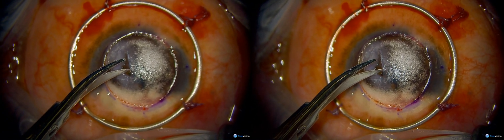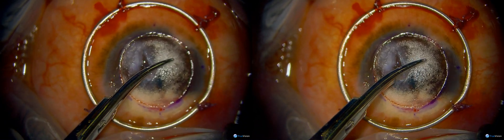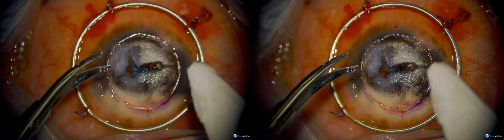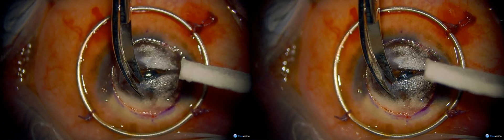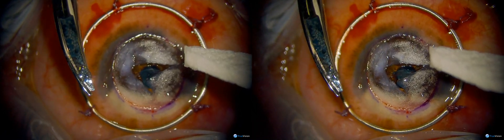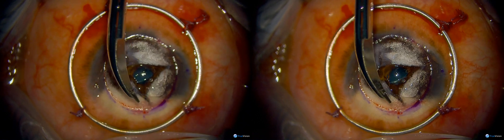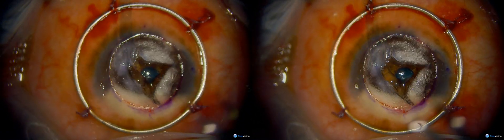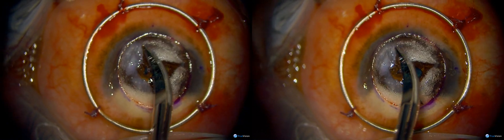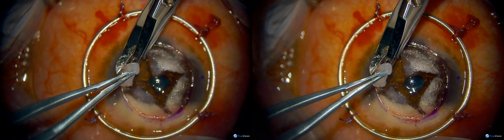These are the scissors that are blunt on the bottom and a little longer on the bottom as well, and she's cutting the lamellae into quadrants so they can be removed. Real care is taken here not to cut Descemet's membrane, always improving the view by removing some of that viscoelastic and always using a little more viscoelastic if needed to push Descemet's membrane and Dua's layer complex posteriorly. It looks like she almost has it in the four-petal pattern here, extending it all the way out to that area of trepanation, which is most likely about eight millimeters. Now she's going to extend it inferiorly with care, as it gets more delicate in that area where there's still less dissection, and now using scissors to remove the four lamellae at the site of trepanation.